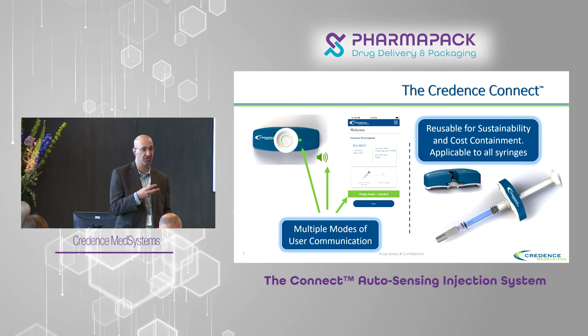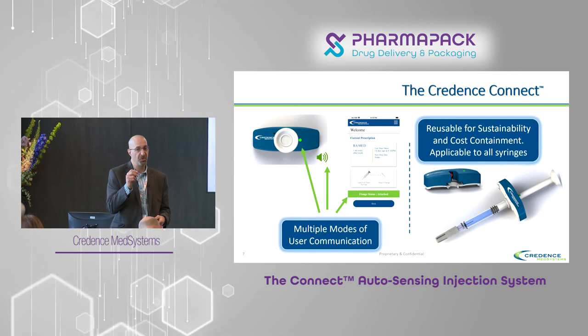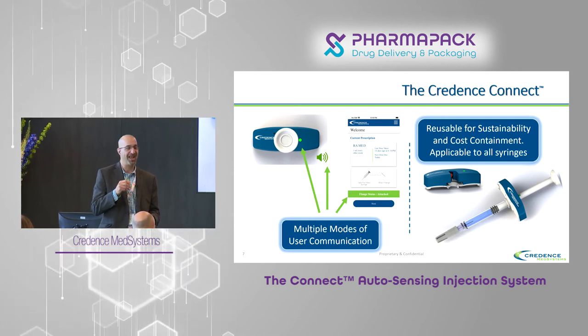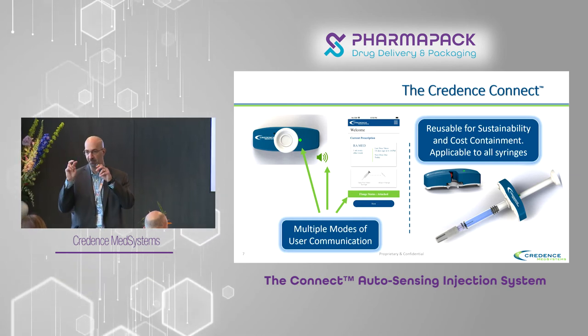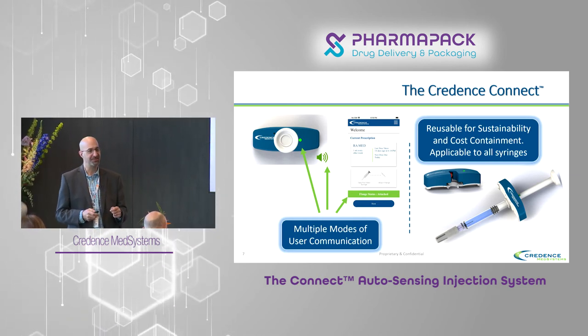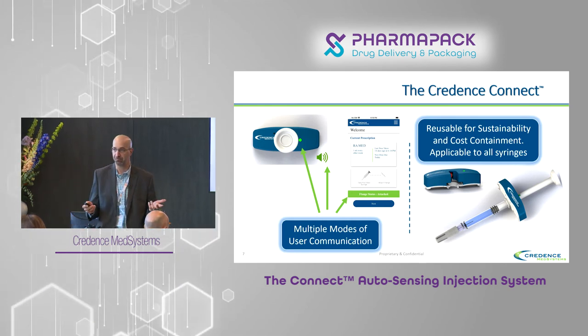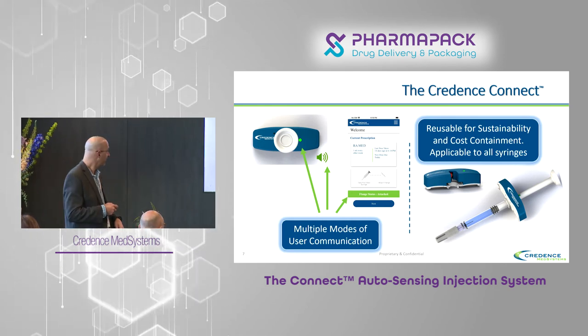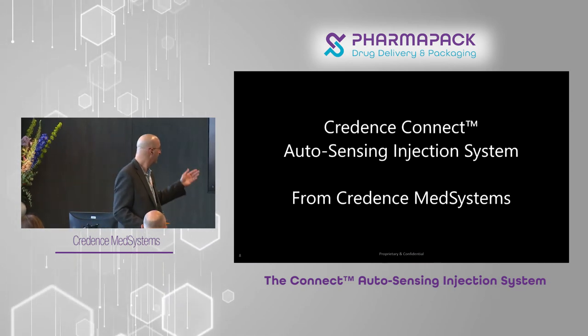So compare the usability of a finger flange to a syringe without it. They're putting on the finger flange, and when they put that on, they get the connectivity for free, right? We're not asking them to put on an add-on device. We're asking them to attach a flange that they need to attach anyway. So I think the next one is the video. Great. This is really where it is most interesting.